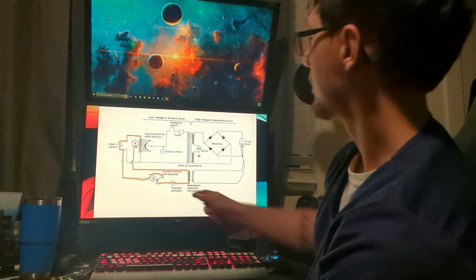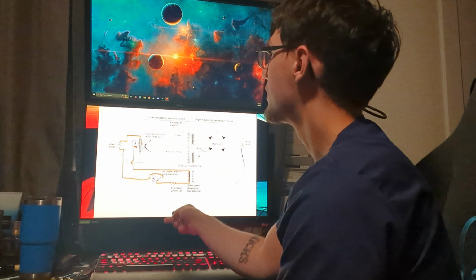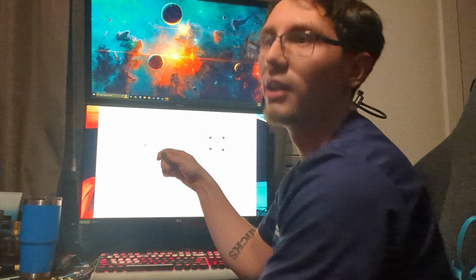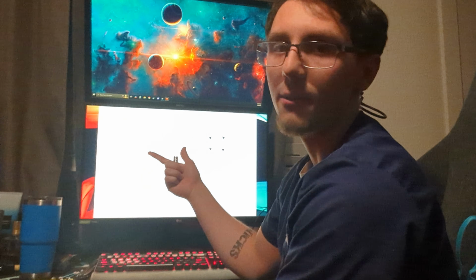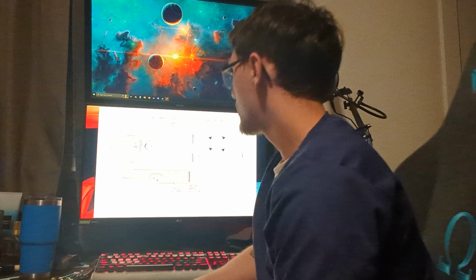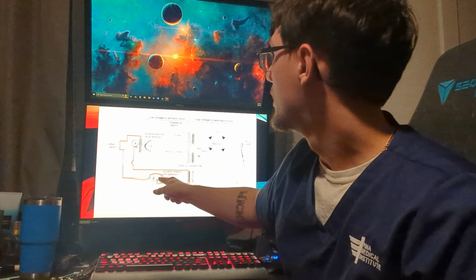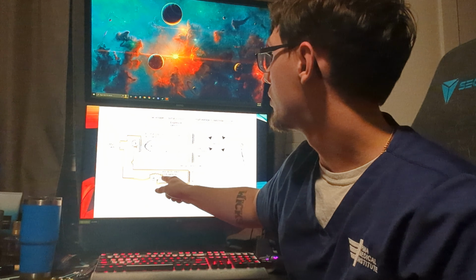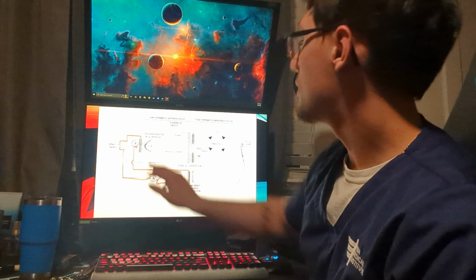So firstly is the filament ammeter. I mentioned this earlier, but all the filament ammeter does is it reads the setting that you put into the control panel, that 60 mA, and it'll send that information over to the variable resistor here. The variable resistor works just like the auto transformer, in that it is a dial or a hand that'll select a certain setting, and then through the use of induction, it'll transfer that current over to the corresponding setting that would mean 60 mA. So this will also be our third point of induction.